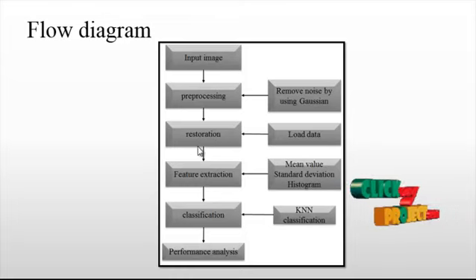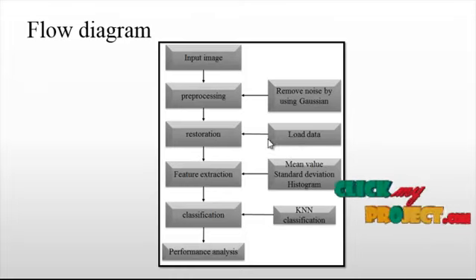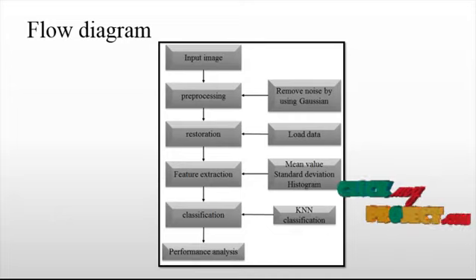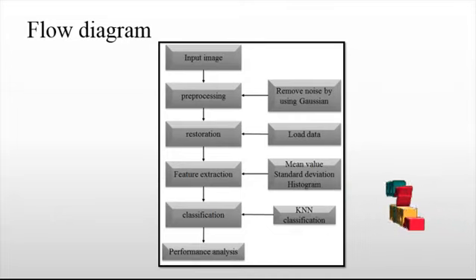The next stage is the restoration process. The restoration process loads the data. The objective of image restoration techniques is to reduce noise and recover resolution loss. Image processing techniques are performed either in the image domain or the frequency domain.